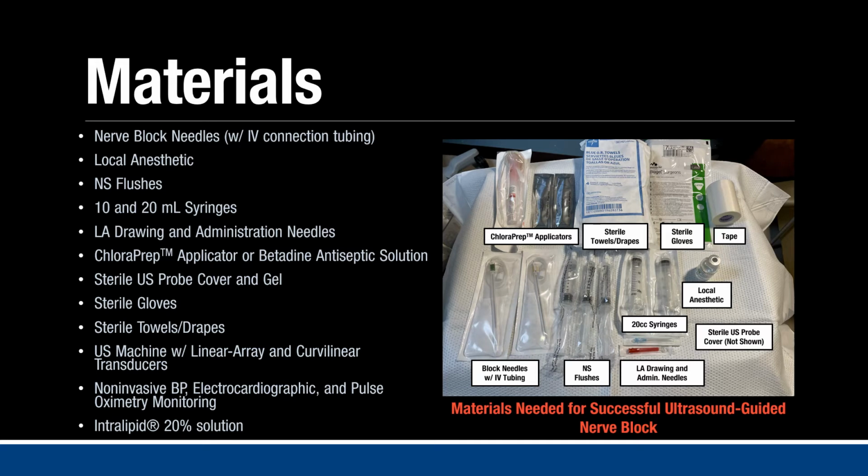So what do I mean by that? So an echogenic needle is one that is readily visible on ultrasound. It reflects the sound waves very well, and it's easier to visualize in an in-plane technique under dynamic guidance, which is critical to avoid inadvertent injury to neurovascular structures or intravascular injection of local anesthetic, which can have devastating complications. A short bevel and blunt tip further reduce the risk of nerve injury or intraneural injection.